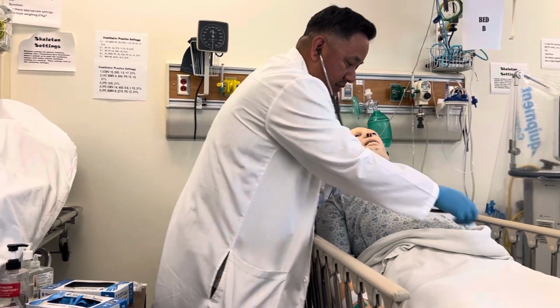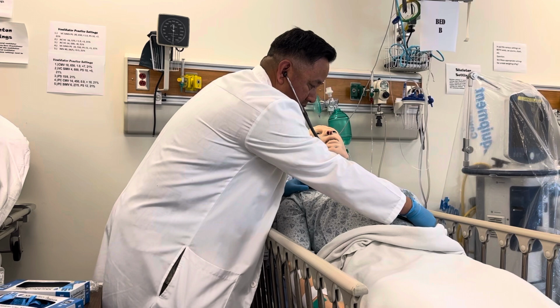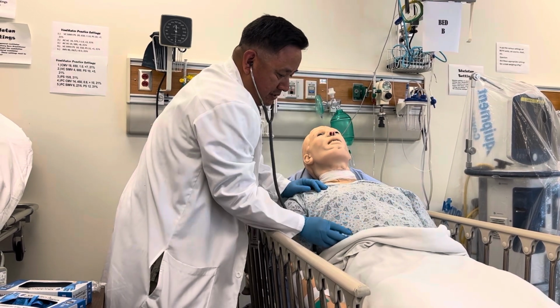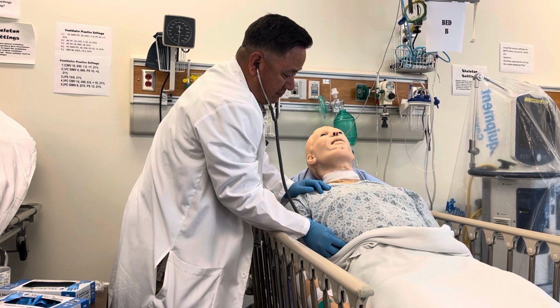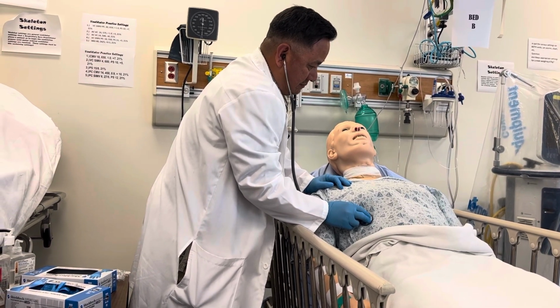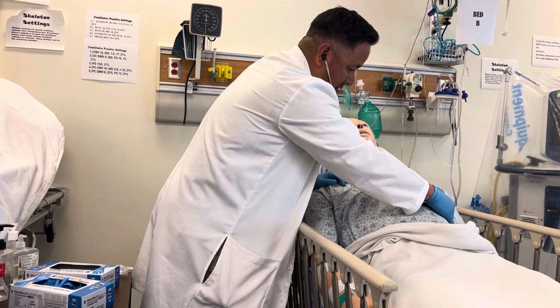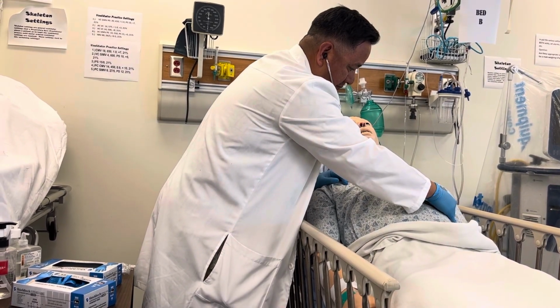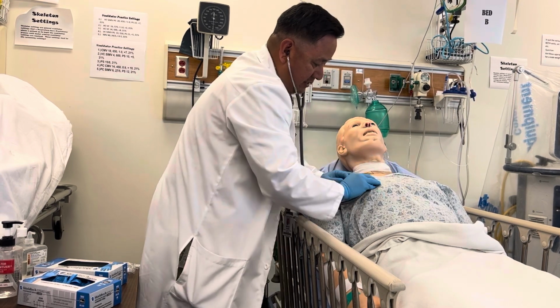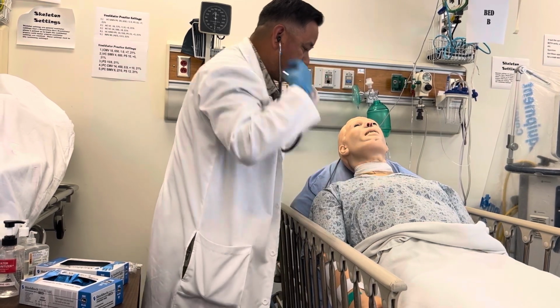Okay, sir. Can you take a nice deep breath in and out? Good. Nice deep breath in and out. Deep breath in and out.